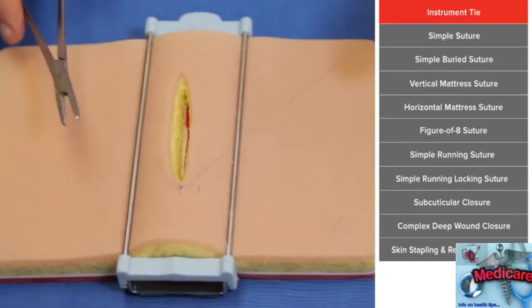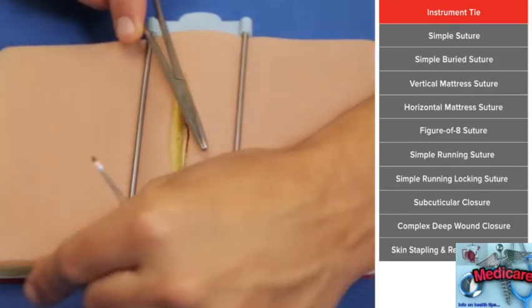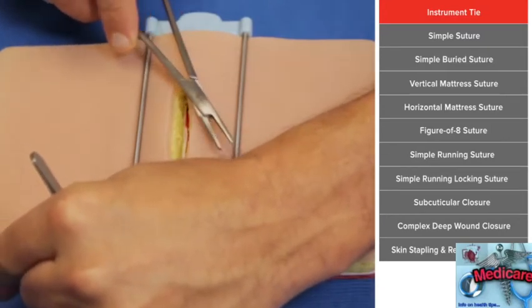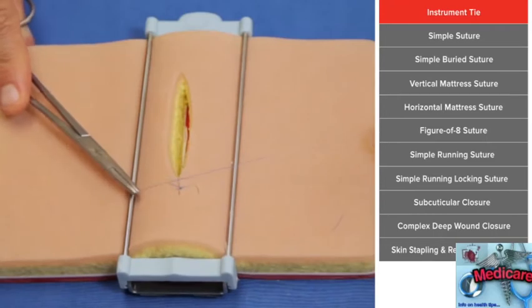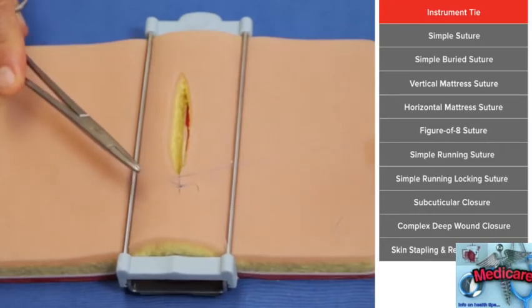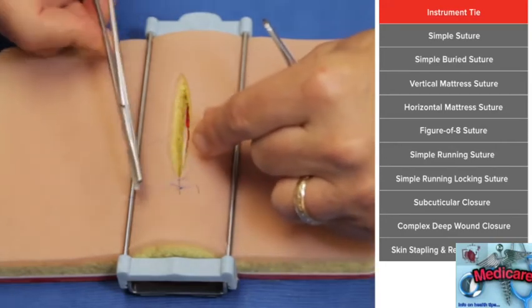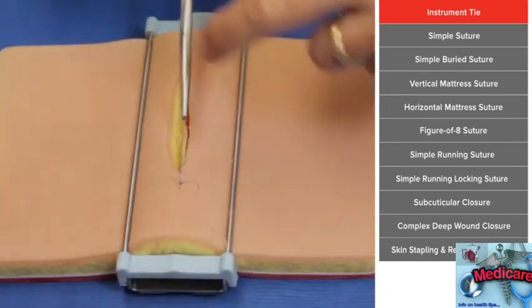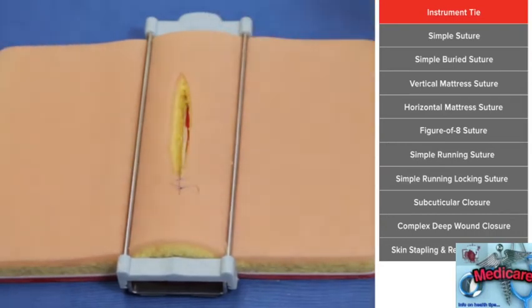So just to review one time, once your suture is placed, leave a short tail, wrap the needle driver twice, pull the short end to the other side, locking it. Now don't pull up on it, wrap just once around the needle driver, pull it back to the other side, lock it down. And now for your next throw, you can go ahead and wrap it once again and pull it to the other side. Now some absorbable suture, you may need to do it 4 times, but 3 times for permanent suture, like the suture that comes in your kit, is fine.